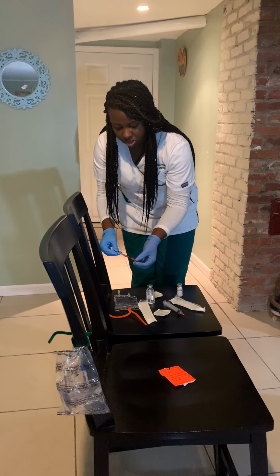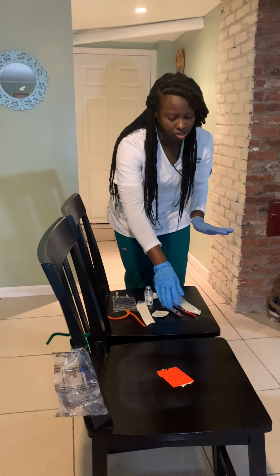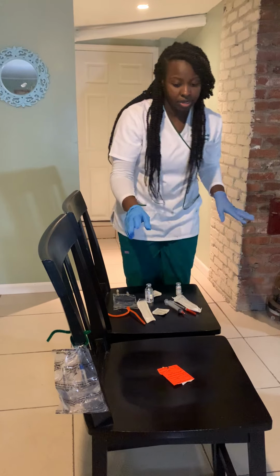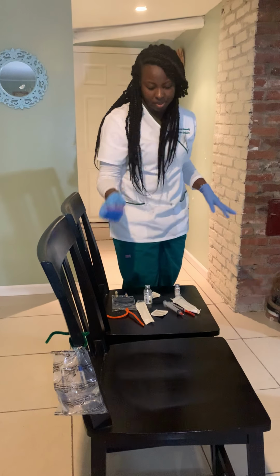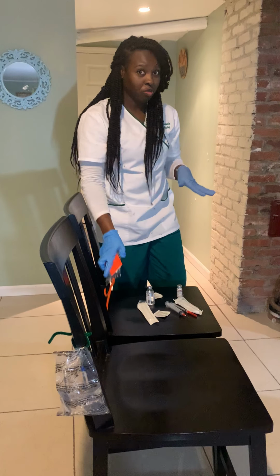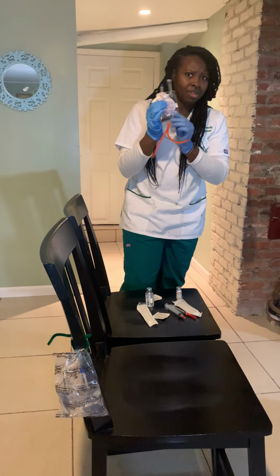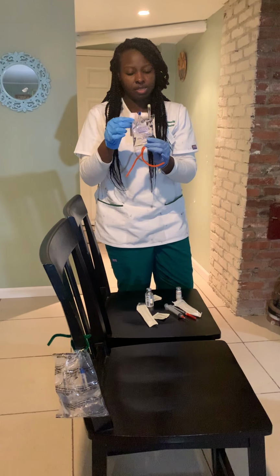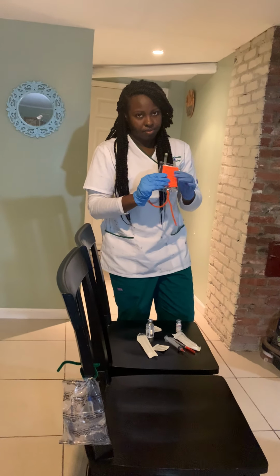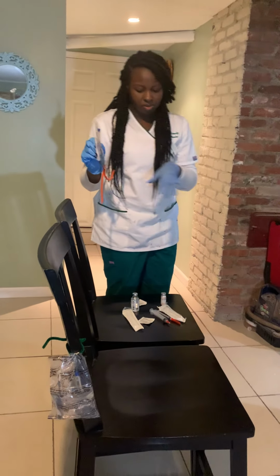And now I'm just going to recap and discard this into the sharps container. All right, and then I'm going to write the patient's name, date of birth, the drug, the amount, the dosage, the time, the frequency, my signature. And I'm going to put this away from the label so they can actually see what it is. And the medication name is still visible.